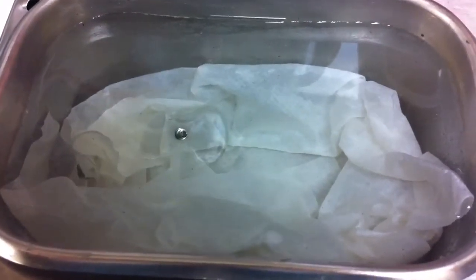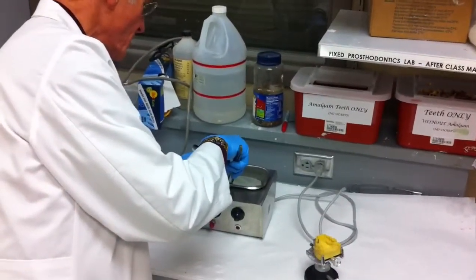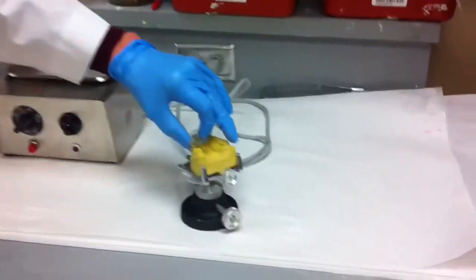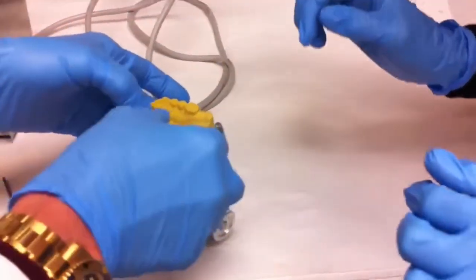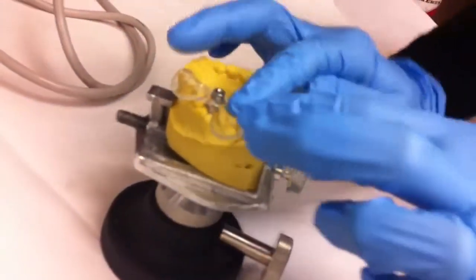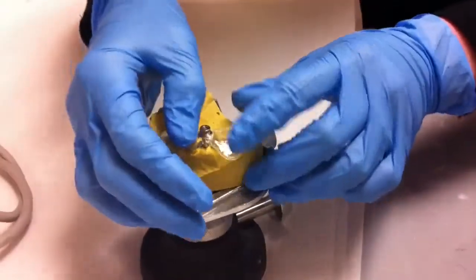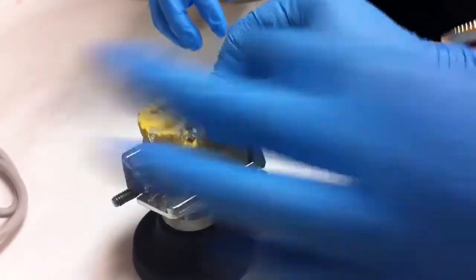It's starting to get clear around the edges — almost fully transparent. So just smush right on the occlusal? Yeah, you've got to smash it down on the occlusals, just about a third of the occlusal surface — just a little bit of the occlusal surface.